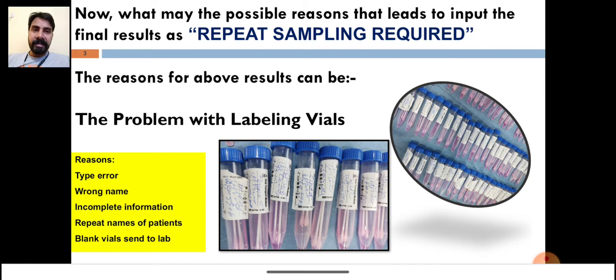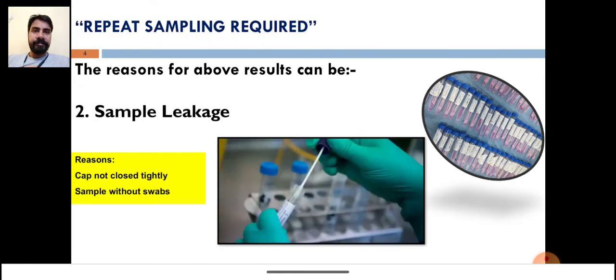The next reason for repeat sampling is sample leakage. The collection facility has collected the sample very well, but they just forgot to tightly close the cap because this is a liquid.